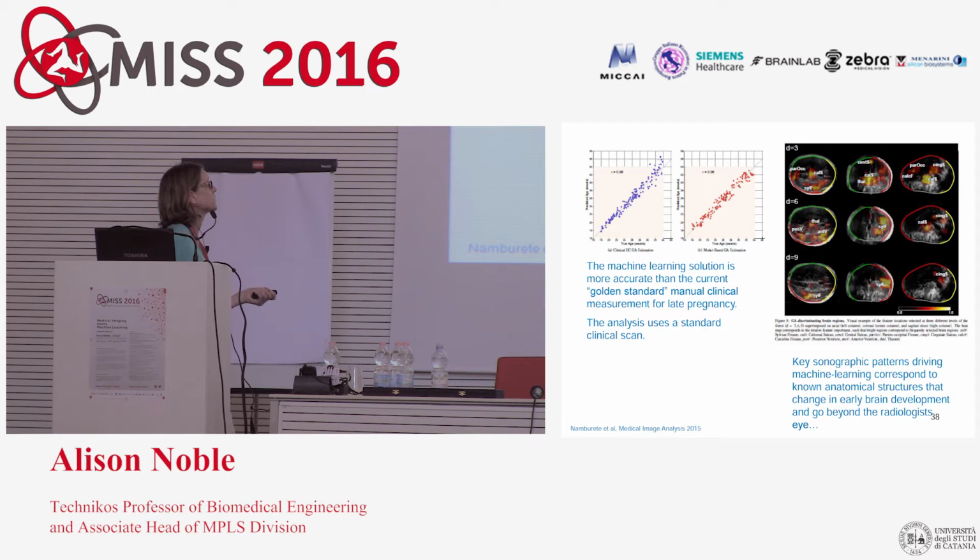The other thing that was interesting as a side thing was that by using random forest, you can go in and look at what features were used to make decisions at which point in the tree. What you find is that the key sonographic patterns that drive this method correspond to the known anatomical structures that MRI and anatomical studies have shown are important for early brain development.